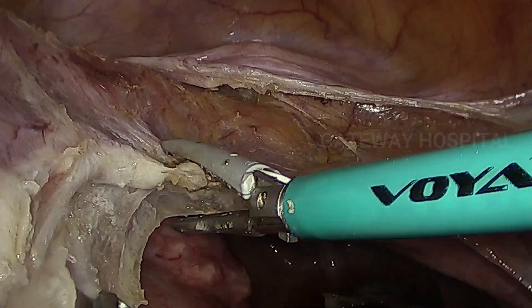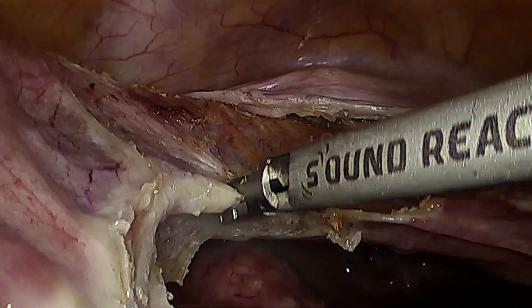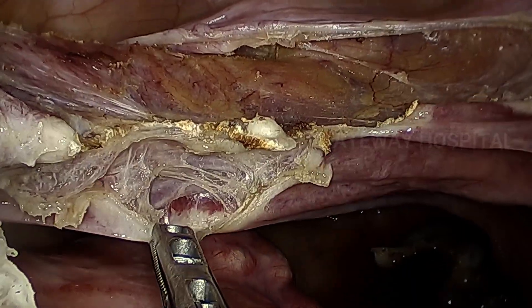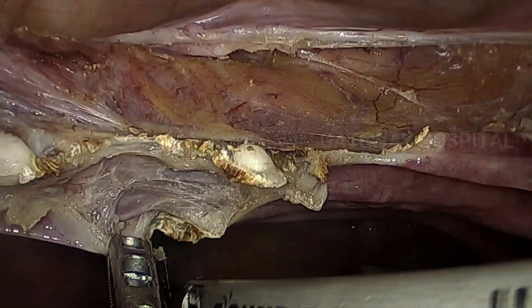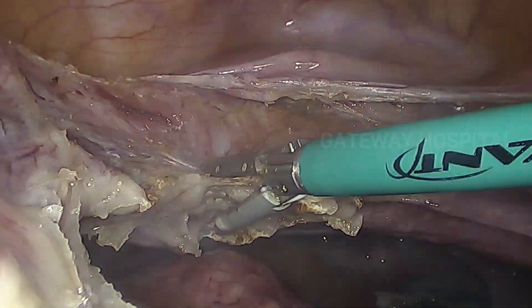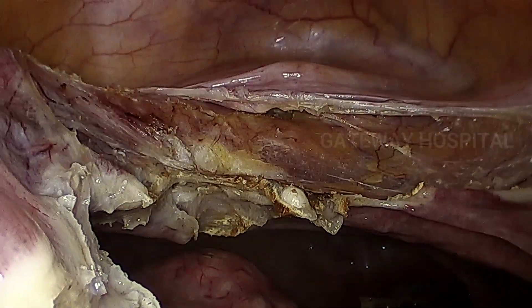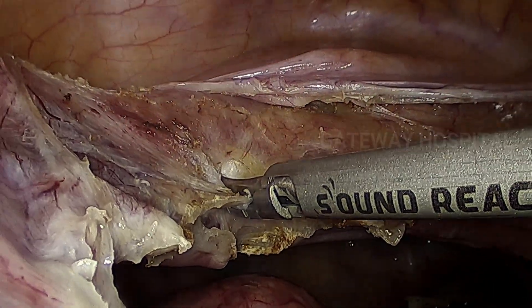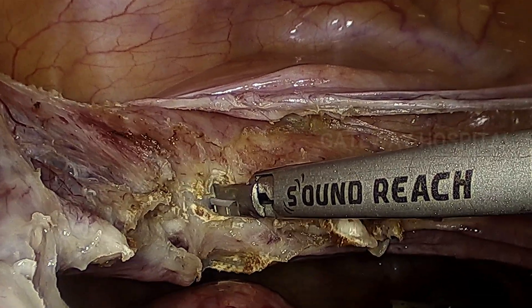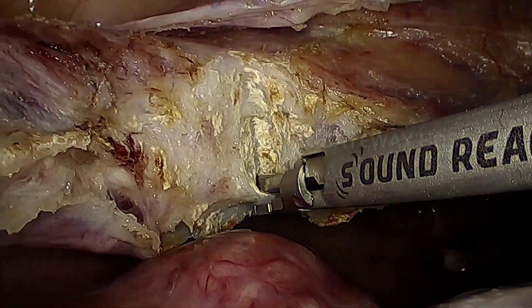If you do this, we can discharge the patient the same day or the next day. A combination of a vessel sealing device and the harmonic scalpel prevents any postoperative bleeding when operating on a large fibroid. You will have larger uterine vessels, so you have to take time sealing them before dividing. Once the uterine artery is divided, closely work on the surface of the cervix, staying on the medial side of the uterine vessel, so there will not be any injury to the ureter.